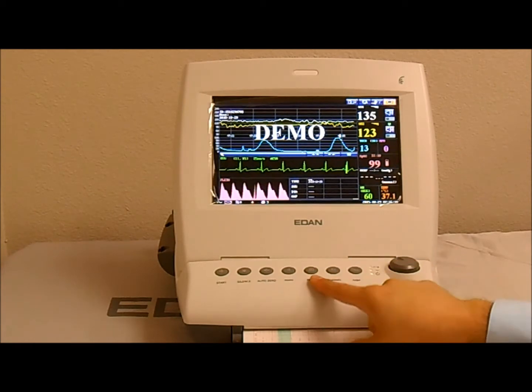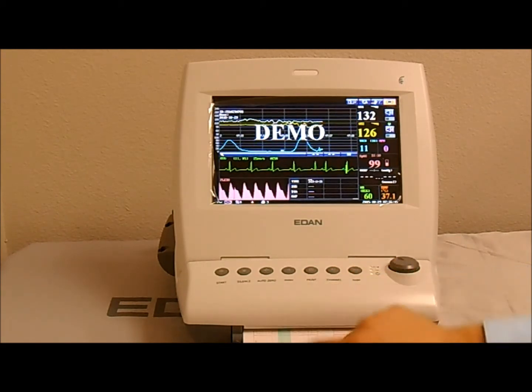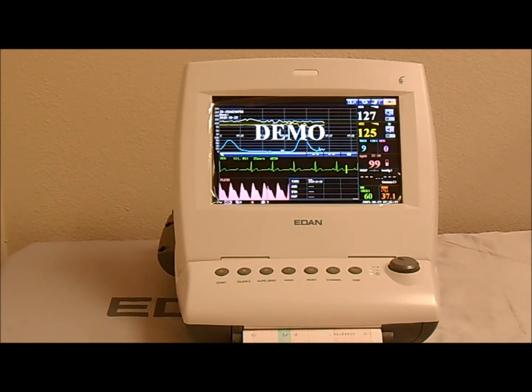Next we have the print key. If you press on the print key, you'll start printing, and if the monitor is currently printing and you press the print key again, it'll stop printing.